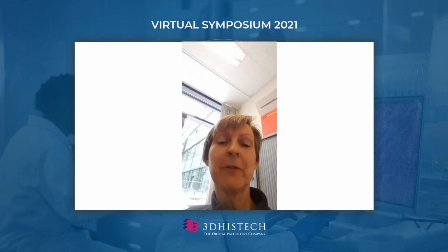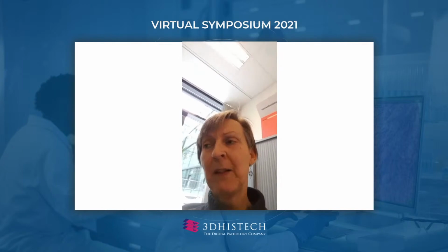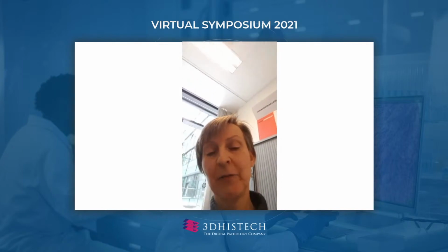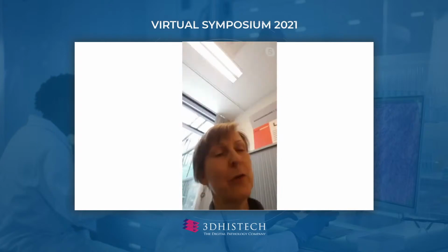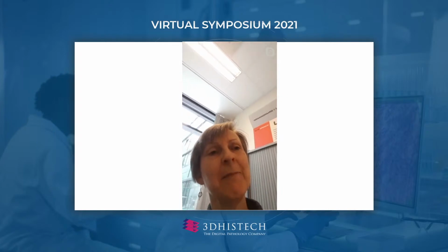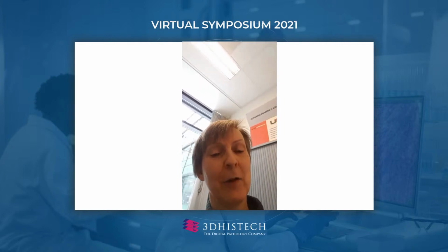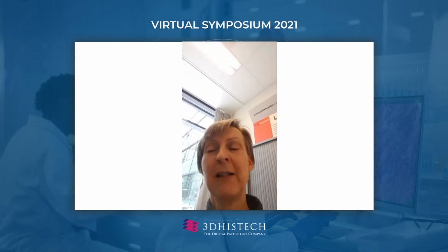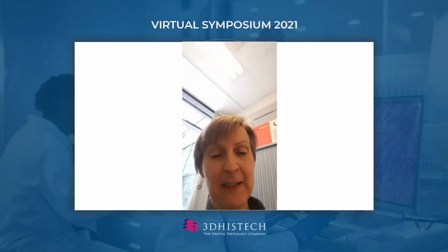But for the larger resections, we have the experience that it takes more time, because on the microscope you can very fast scan a large resection without zooming in, and our experience is that you have to zoom in more and really screen the digital slides of large resections more. So that is slower, but all small tissue is really very fast and really beats the glass slides.